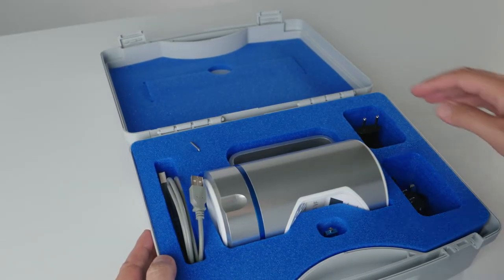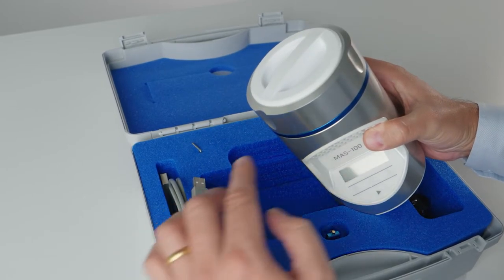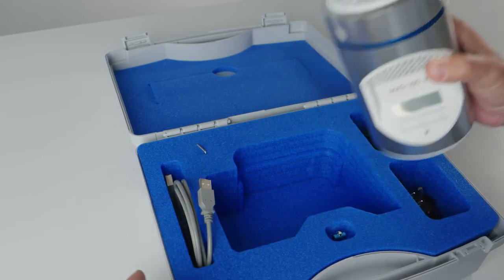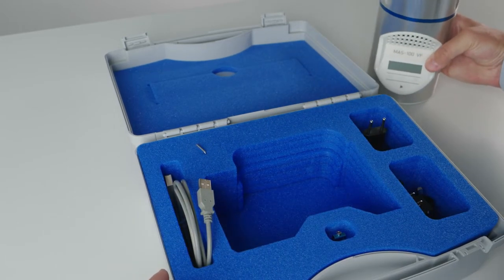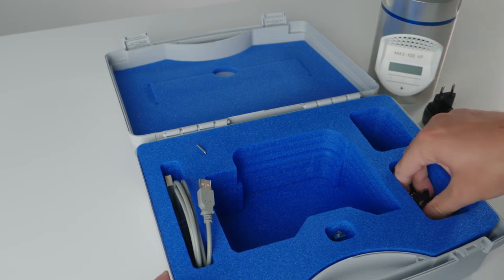First, we have our main product — the VF — in a protective custom cut-out foam. A perforated lid and a dust cover are already fitted. Then we have the power supply, including adapters for different outlets.